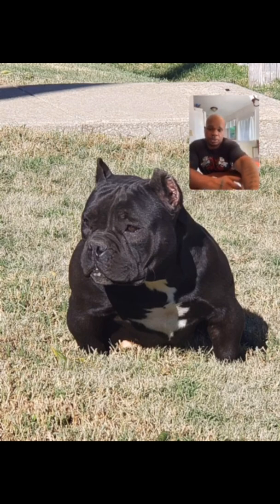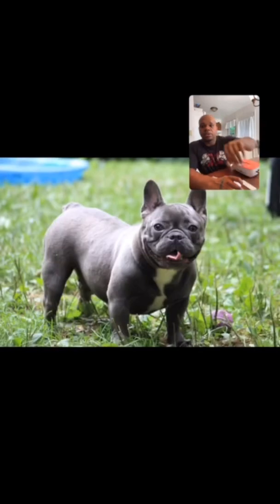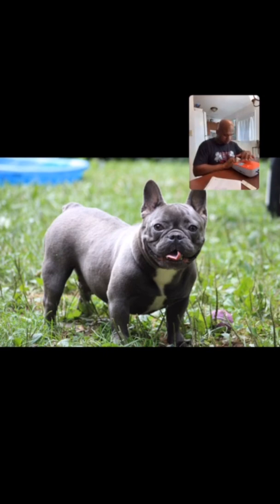Now we're going to be testing Luna. There she goes — this is Luna. Let's see where Luna is at. Luna is at a 3.483. I'll print that out. She's not ready yet — she's climbing but she's not ready.